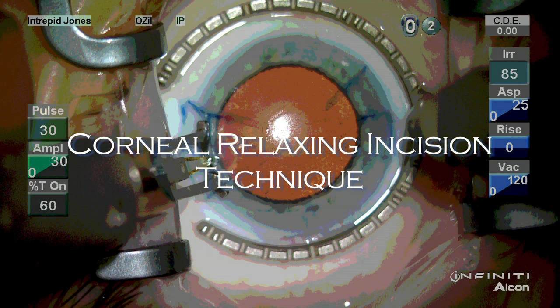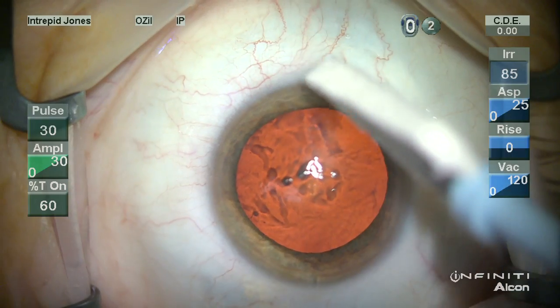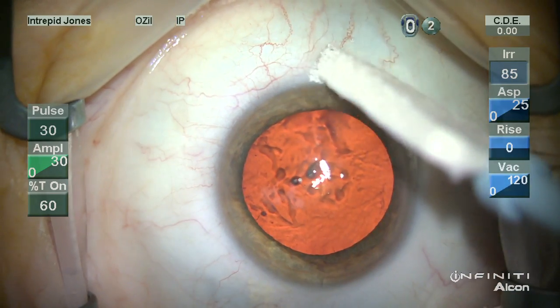In this video I will demonstrate my technique of corneal relaxing incisions. My name is Jason Jones and I have no financial interest in any of the products demonstrated or discussed.